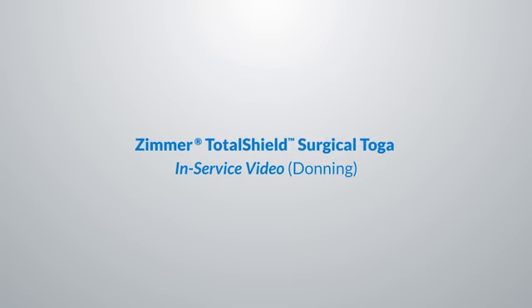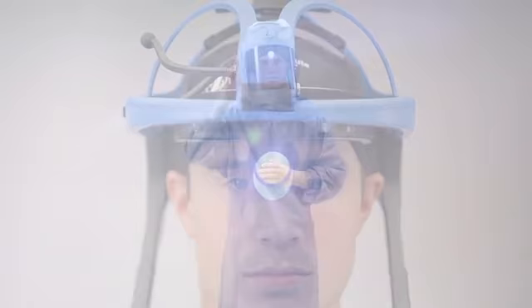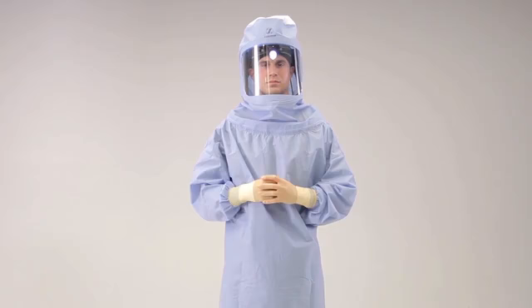Hello and welcome to the video tutorial on how to don the Zimmer Total Shield Zippered Surgical Toga. The Total Shield Surgical Toga is for use with the Total Shield Surgical Helmet and Total Shield Advanced Surgical Helmet with LED lighting. The Total Shield Surgical Helmet System is intended to be worn by surgical personnel to provide a barrier between the operating environment and the surgical personnel in order to protect against contamination and exposure of infectious body fluids and harmful microorganisms.